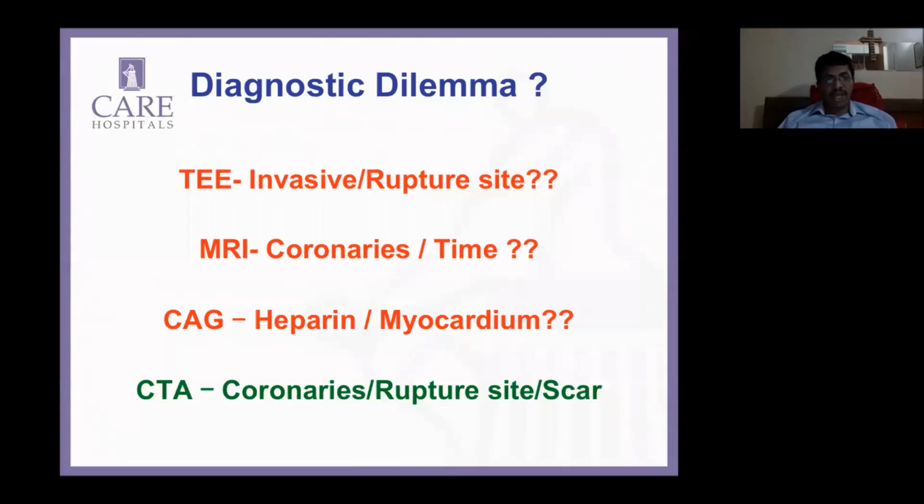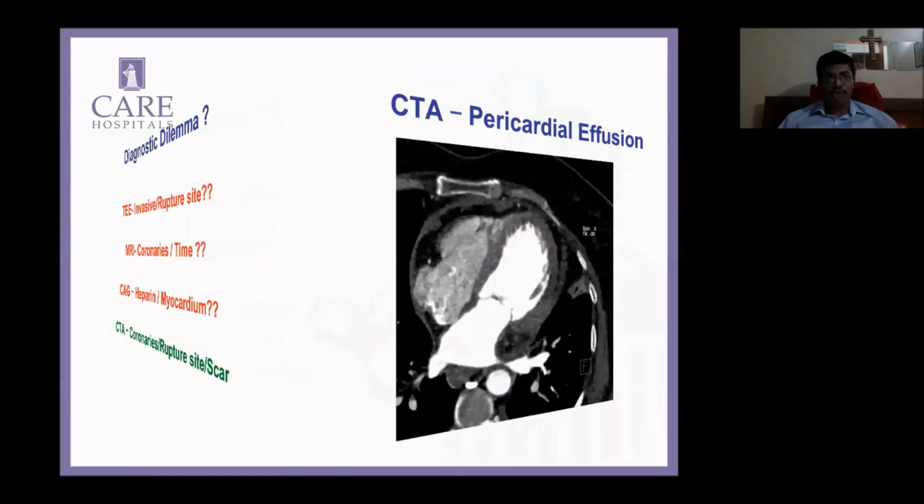The other 9 patients, or 8 patients, I'm happy to report, and we have sent this for publication, and I'll show you that. We looked at those ruptures and sent them fairly early straight to the CT OR, not via the cath lab, and they've all been fixed. So this is my experience. And I'm going to show you this index case.